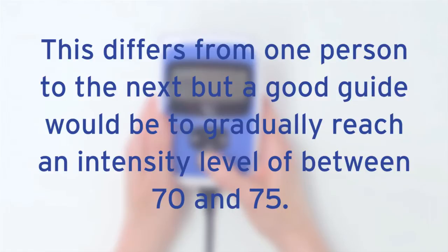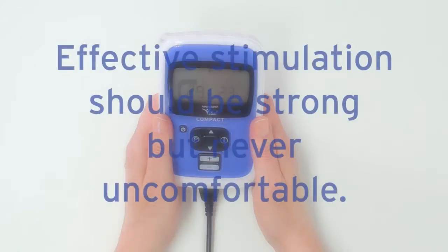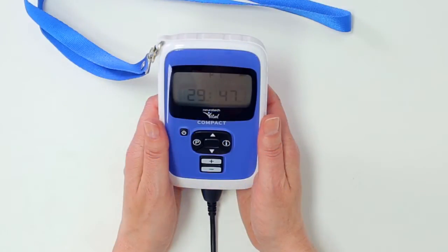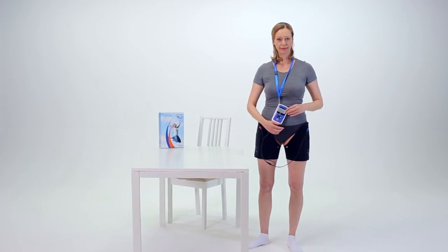This differs from one person to the next, but a good guide would be to gradually reach an intensity level of between 70 and 75. It may take several sessions to reach this intensity, but remember never to exceed your comfort level. Effective stimulation should be strong, but never uncomfortable. You can clip the lanyard onto the controller to hang it around your neck if you wish. Alternatively, you can hold the controller in your hand during the treatment or place it on a surface nearby.